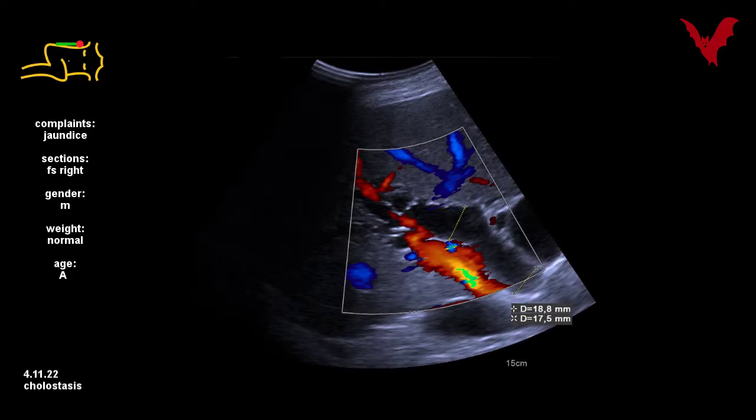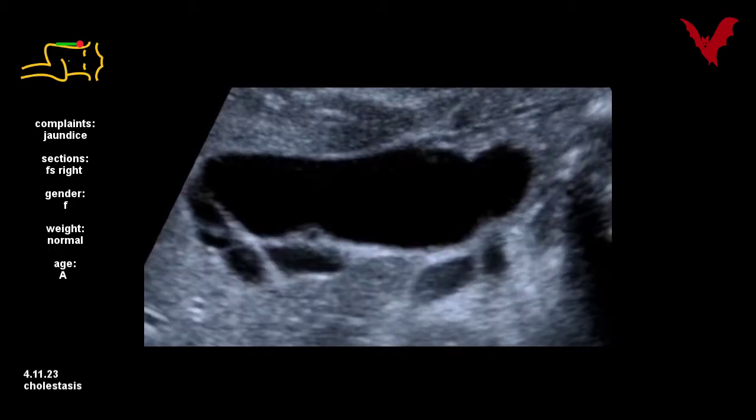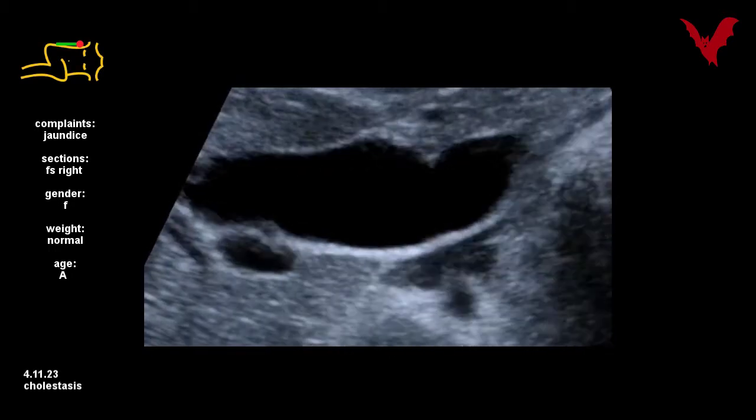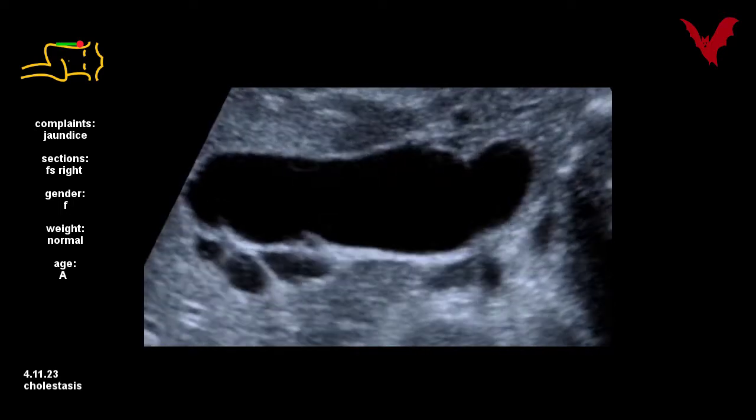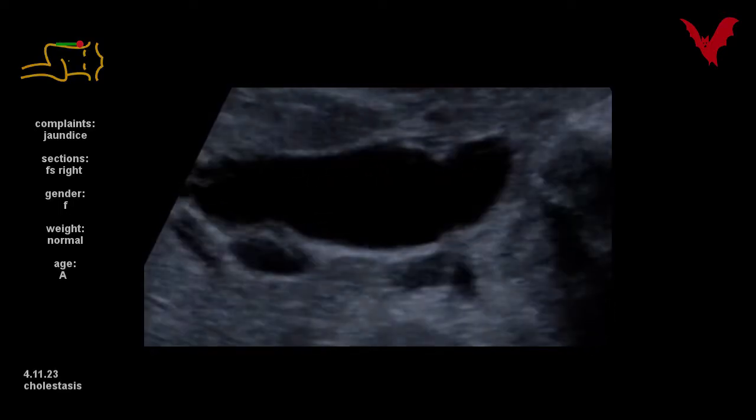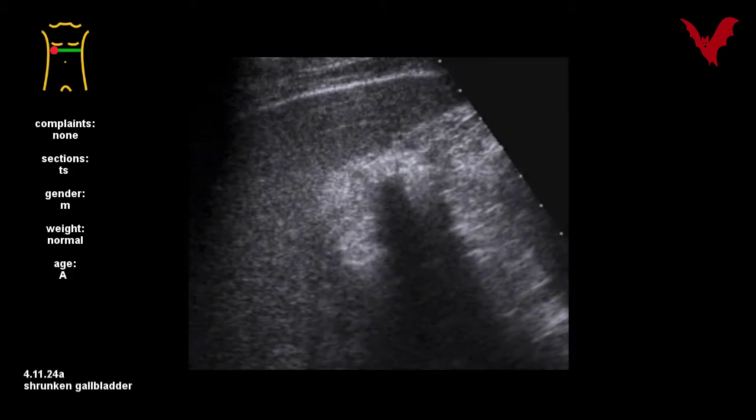This clear case in figure 22 demonstrates once more features in biliary obstruction. An enormous dilatation of extrahepatic bile duct is shown. Please note the intercrossing right branch of the hepatic artery. These three different cases in figures 24, A to C, are all stone related.